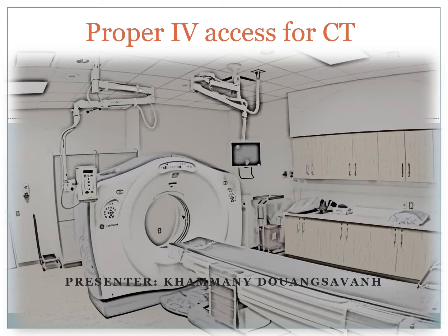In CT, some exams come with contrast, and the contrast is very viscous, so it's very important to understand what type of IV access we have for the patient in order to give the contrast, to enhance the contrast to find the correct pathology that we need to see. So let's get started.